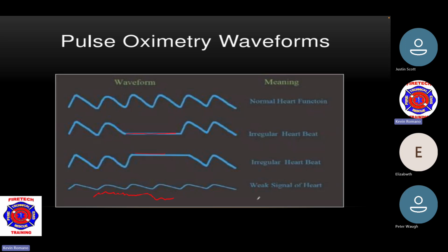And we're going to go over a little thing together here in a project. I don't know if you guys have your cardiac monitor out and things like that. Do it afterwards as a group and just try this out. Or maybe on a break, you could take out your cardiac monitor and try it out. We're going to go over that little task here in a little bit. So we're looking at our different waveforms on our monitor, looking at our normal, whether it's irregular, things like that.